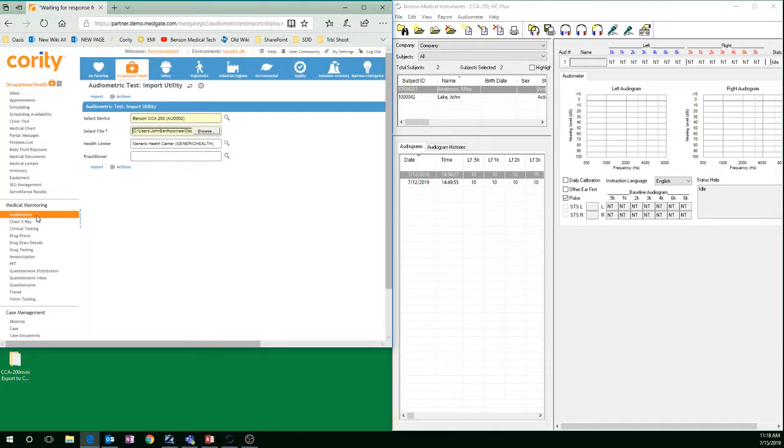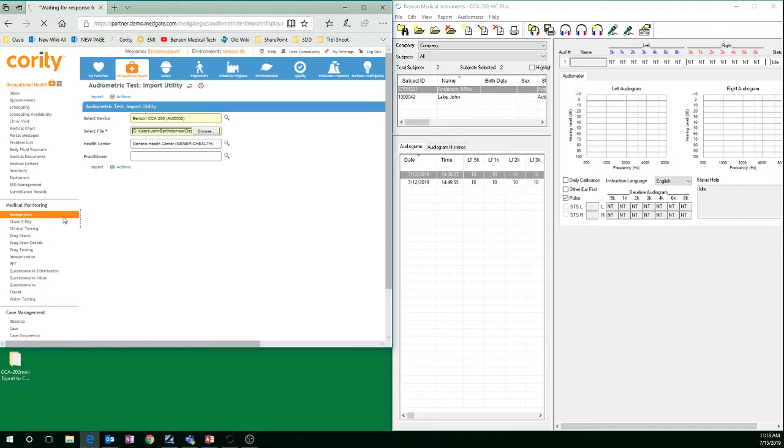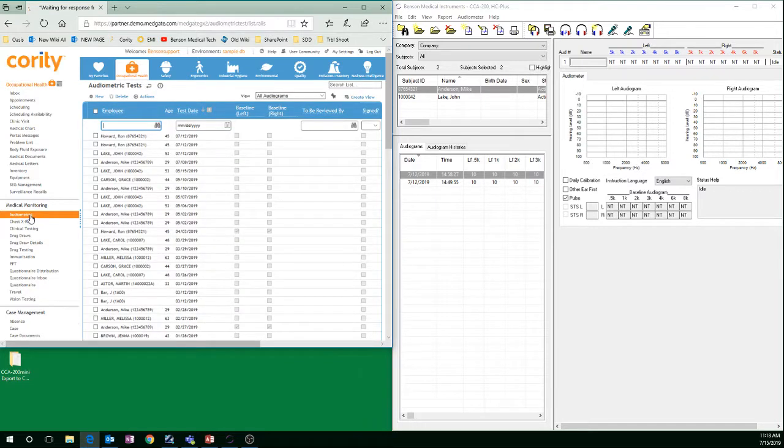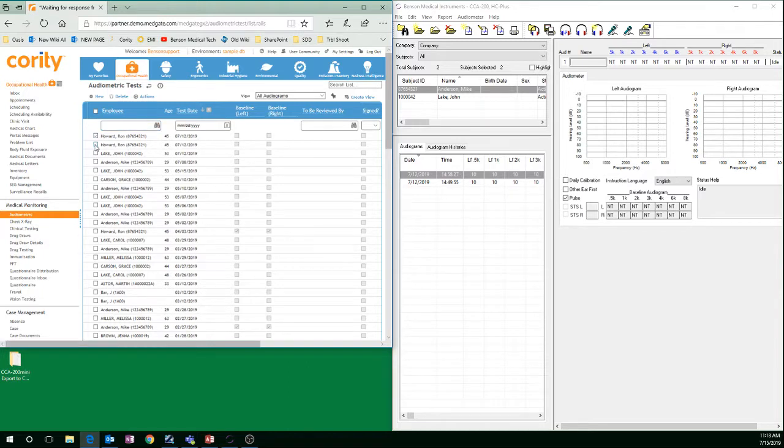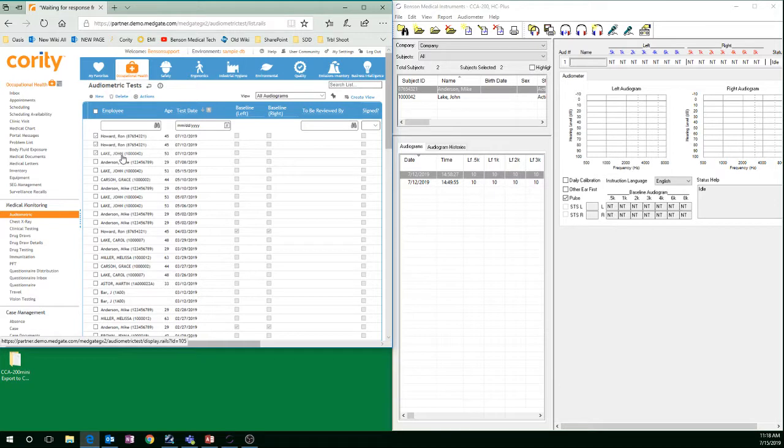If I want to see those records, I can go to the Audiometric portion again. And those in here are the three records that I just added into my Audiometric tests.